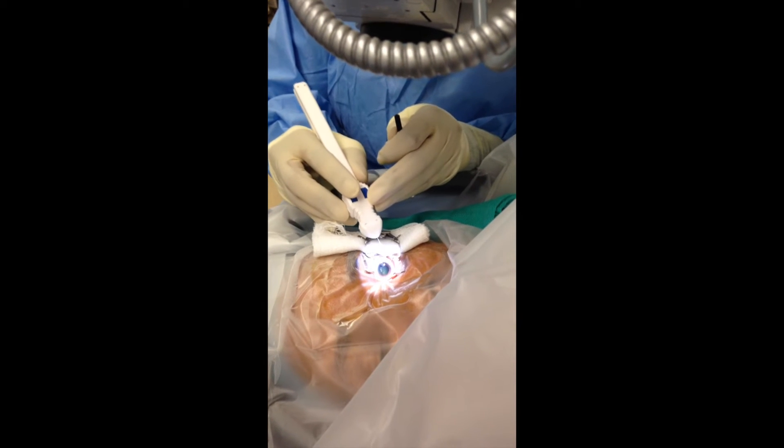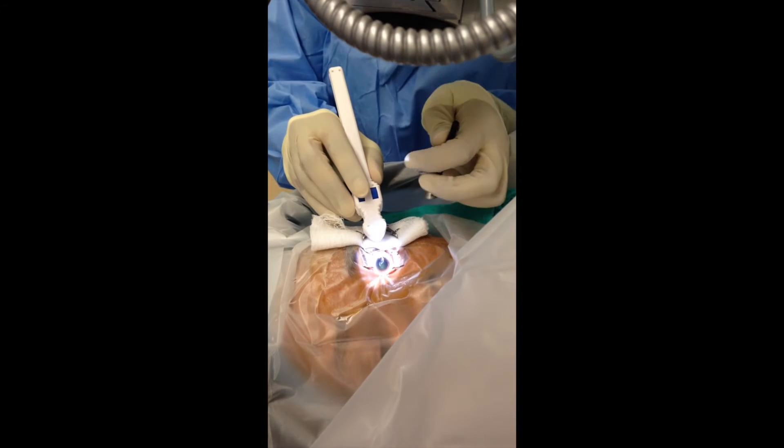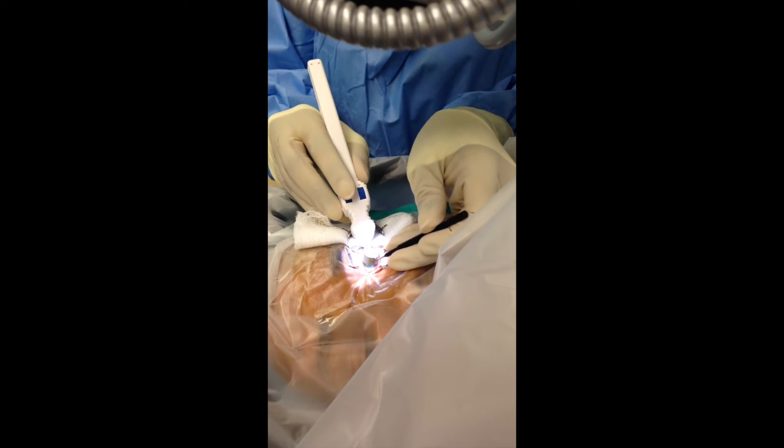An initial corneal incision has been made, through which the instrument is introduced into the anterior chamber, slid across the eye to the trabecular meshwork. The gonio lens is placed so the view is adequate.